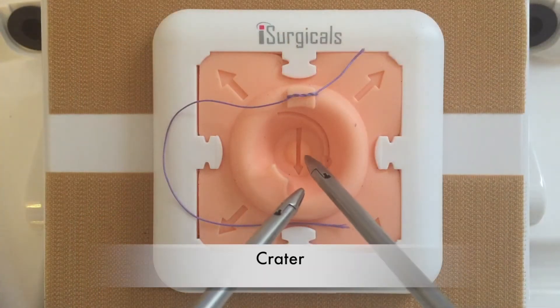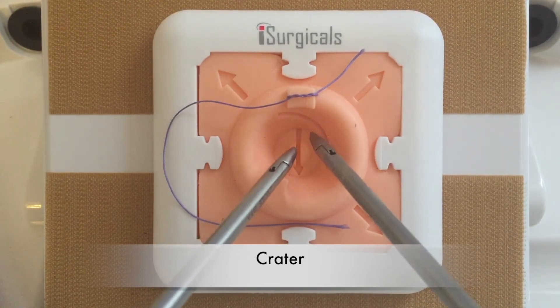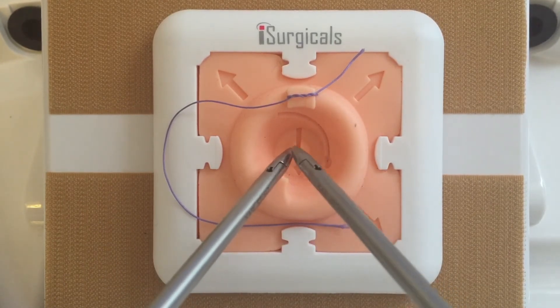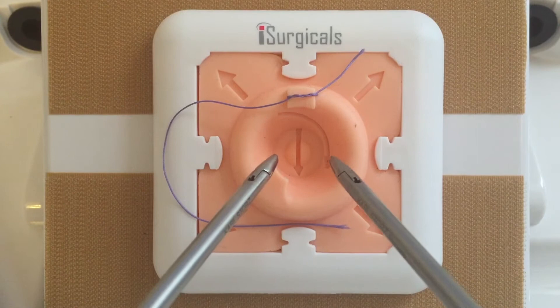The central crater has been developed to keep the needle holder tips together and towards the knot, which are crucial in successful knot tying. It also helps to develop muscle memory for making small circular movements. The arrows in the crater guide correct movements and directions of instrument tips for making a loop for different knot tying techniques.